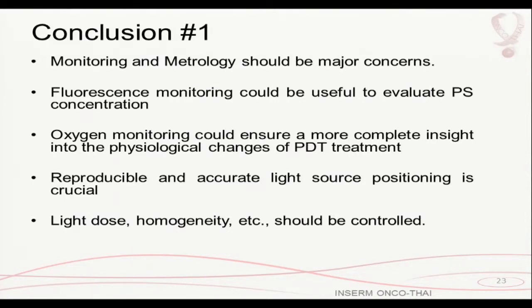So, first conclusion of my talk. Monitoring and metrology should be major concerns. Fluorescence monitoring could be useful. Oxygen monitoring could ensure more complete insight. Reproducible and accurate light source positioning is crucial. And light dose homogeneity, etc., should be controlled.